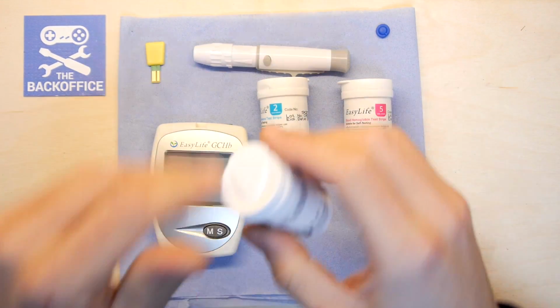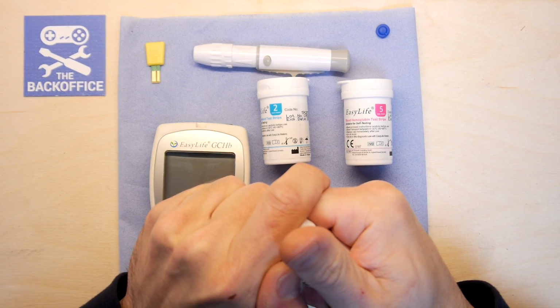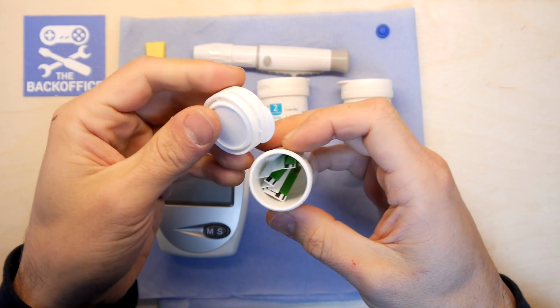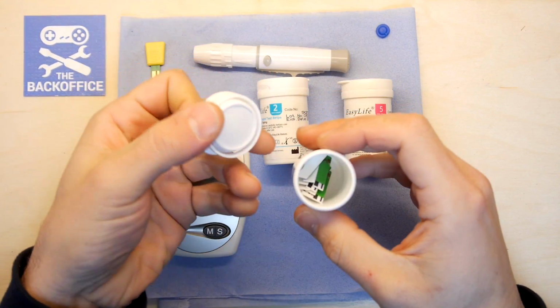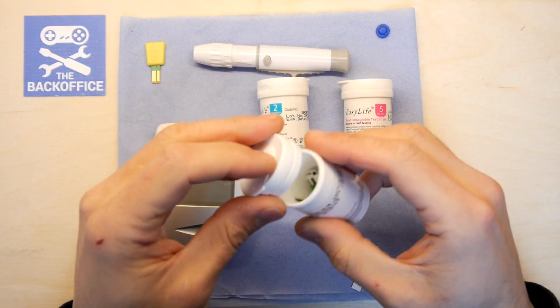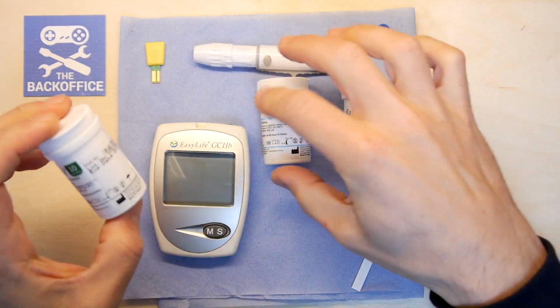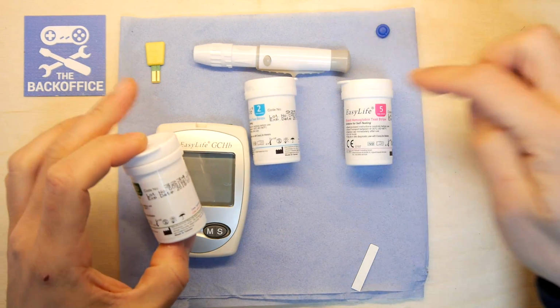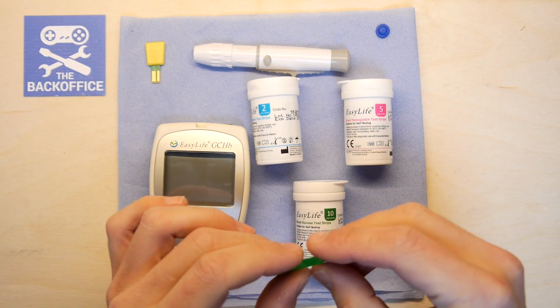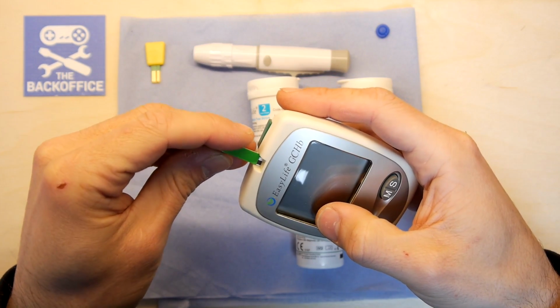All that's left now really is to drop some blood on a strip. That's a very firm lid. I sort of managed to remove it entirely then. So I'm going to take one strip out. You get 10 test strips for blood glucose in this kit, 2 for cholesterol, which is very expensive, and 5 for hemoglobin. So if you're going to do the cholesterol one, you want to really go for it. You don't want to mess around. It's expensive. So we're going to plop the blood glucose in.